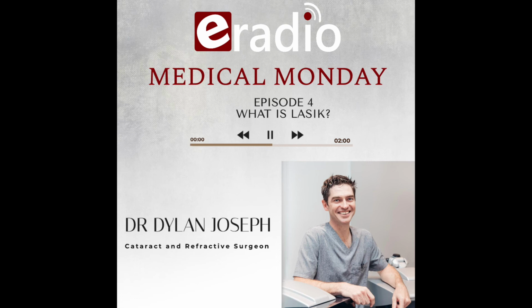Keratoconus, for instance. Keratoconus was long believed to be a disease of the cornea that we can't touch. We can't do anything, and cross-linking is the only thing that we can do. Cross-linking is where we expose the cornea to ultraviolet and to riboflavin, a solution which stiffens the corneal bonds. Because remember, we talked about keratoconus earlier being a weakening of those corneal bonds, and the cornea slowly starts to collapse. But what we can do now is actually take the topography, so have a look at where the lumps and bumps are on the cornea, tell the laser to smooth those lumps and bumps out, to improve the quality of vision, not to get you out of spectacles or contact lenses.